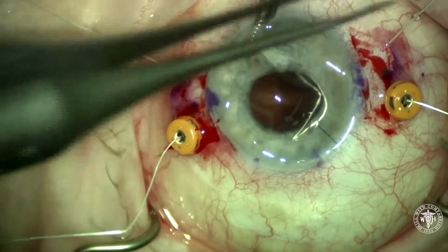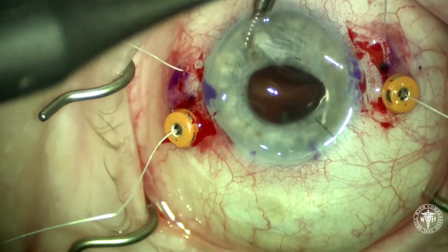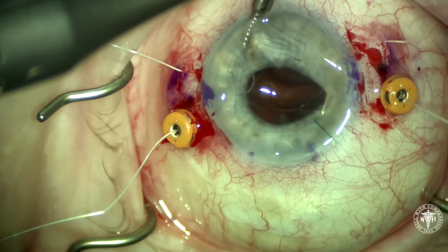Unfold, and then you can pull on your Gore-Tex suture and the implant will pretty much center itself in the eye.